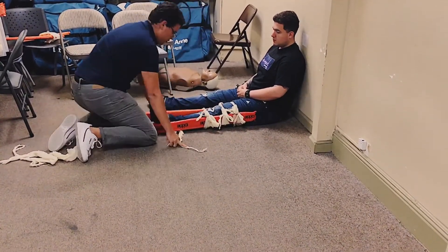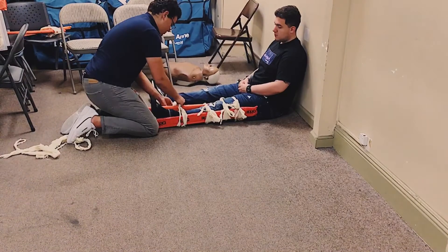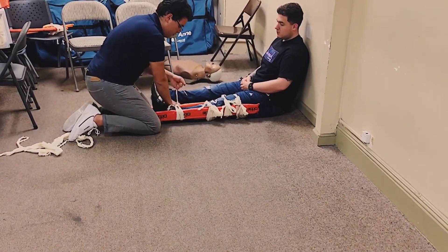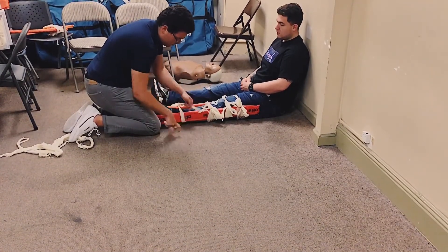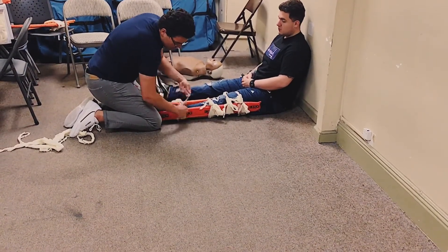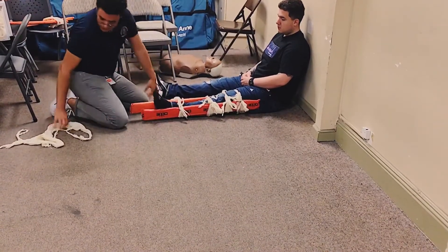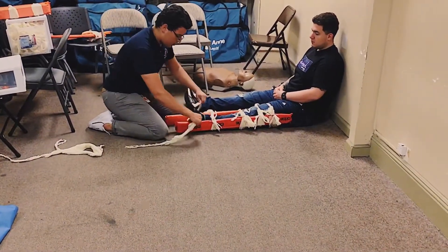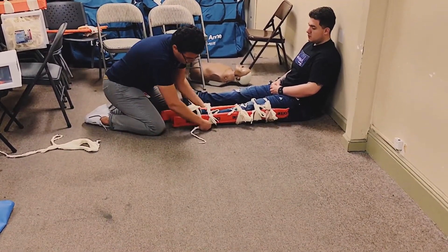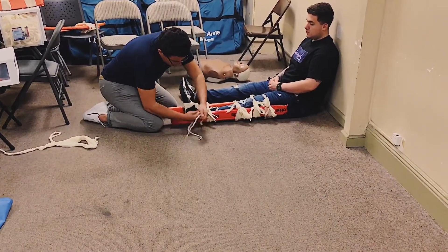Above and below the injury side. Surgeon's knot and then one more on top. Now we're going to do our ankle hitch, tying off on the outside.